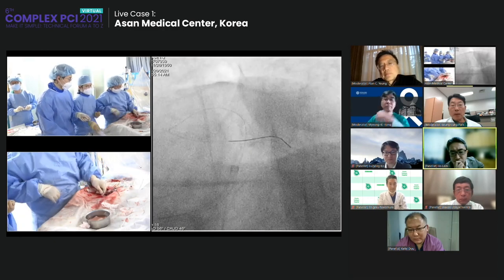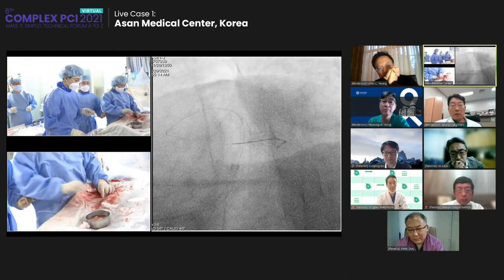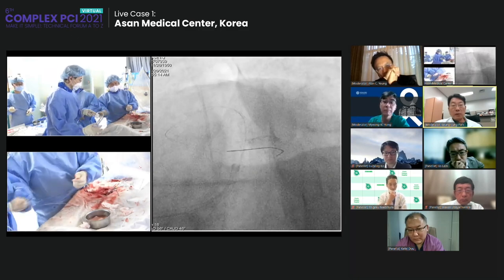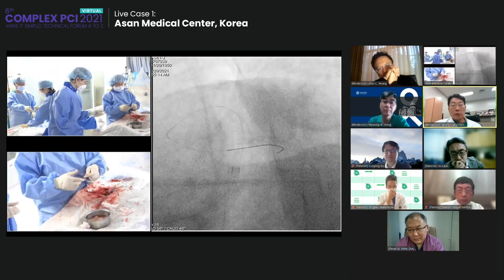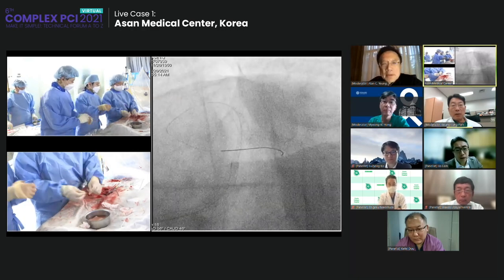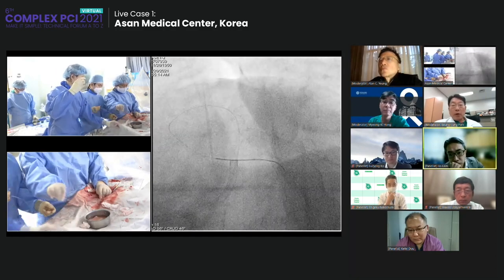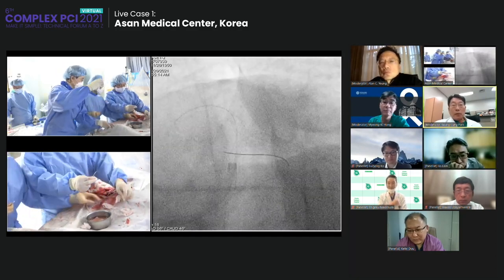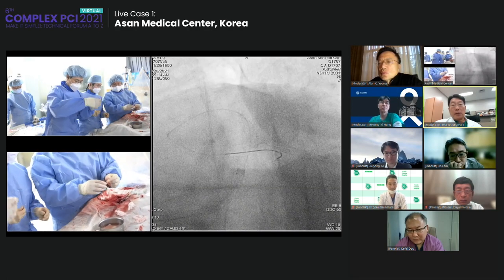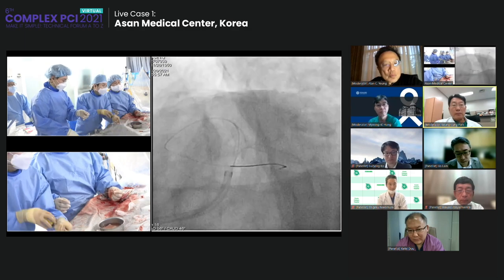So I like to apply the high pressure balloon for circumflex and LAD. Circumflex what size? 3.5 for circumflex, 4.0 for LAD. All right, great. Circumflex, 3.5. All right, Dr. Han, for a minute we're going to move to the first cath lab, and we're going to see the final result, and then we will be back.